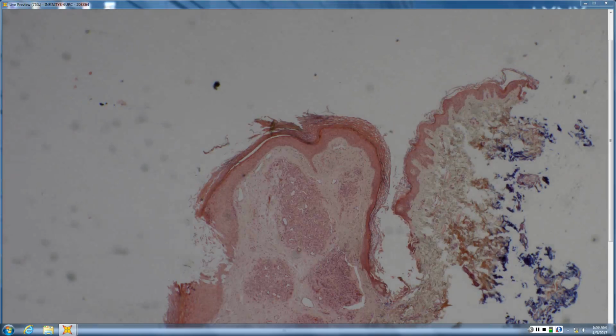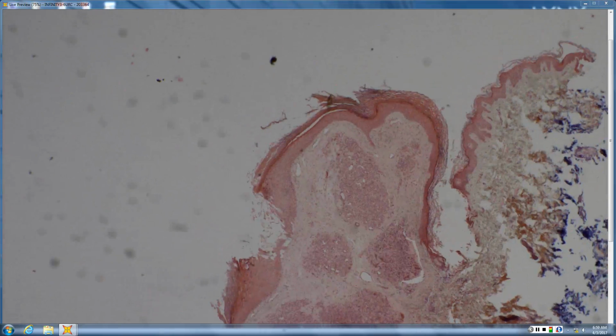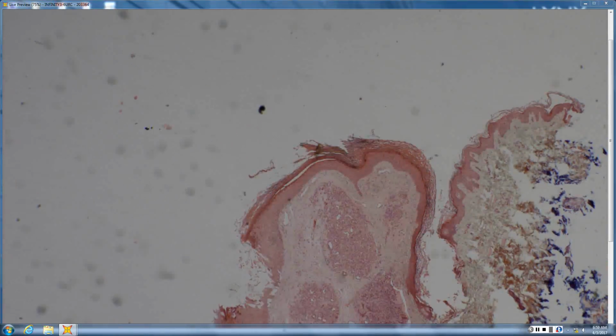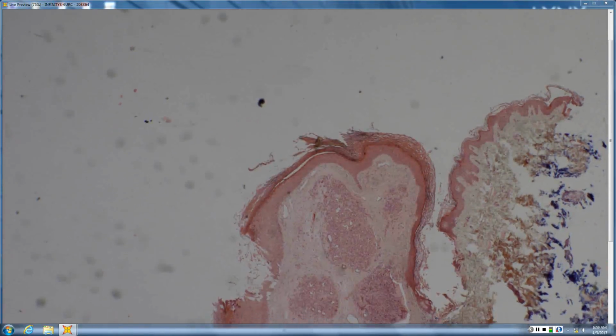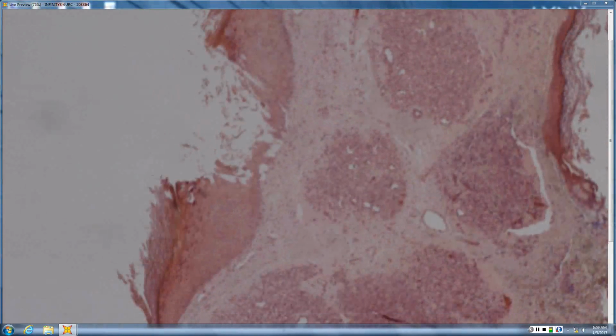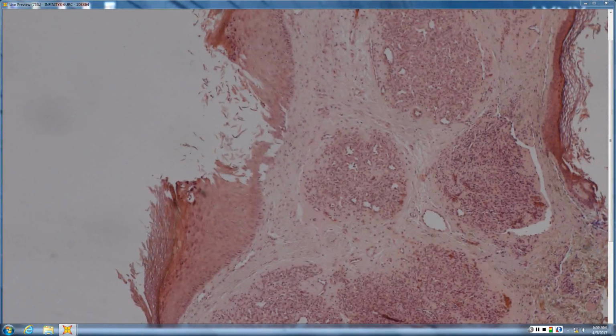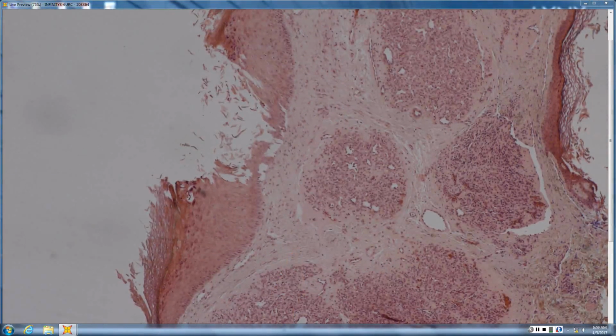Okay, so number 5 is a pyogenic granuloma or lobular capillary hemangioma. And, of course, we're trying nowadays to go more to that LCH terminology. It's certainly very descriptive. I still call it a PG, though, just out of habit, but it's very much lobulated or lobular.